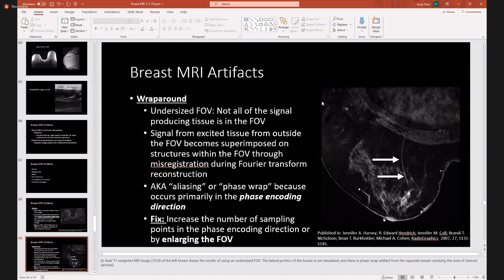Wrap-around artifact is where you have an undersized field of view and not all of the signal-producing tissue is in the field of view. This is also known as aliasing or phase wrap, because this occurs primarily in the phase encoding direction. How do you fix it? You increase the number of sampling points in the phase encoding direction, or you just enlarge the field of view, which is typically what we do in clinical practice.